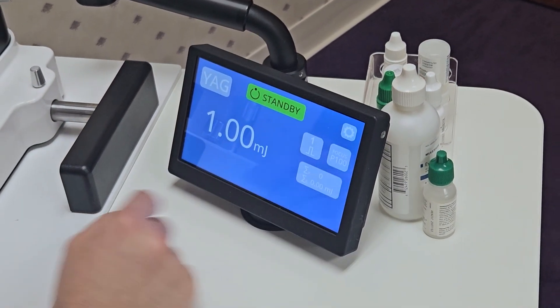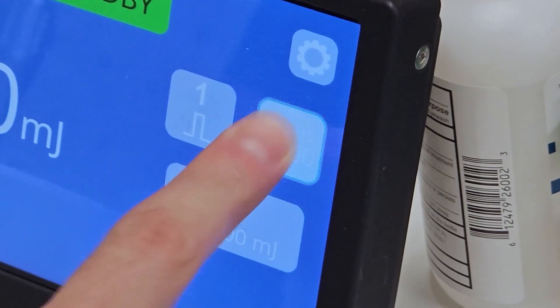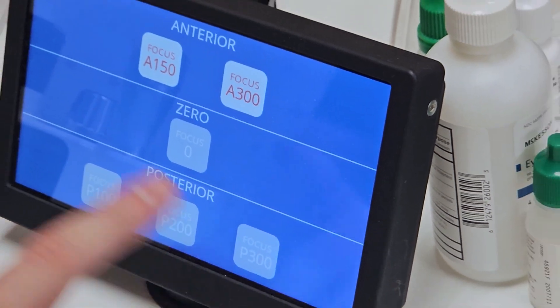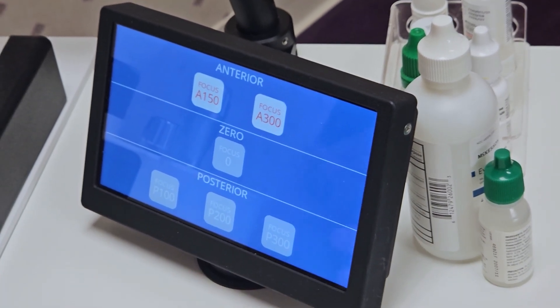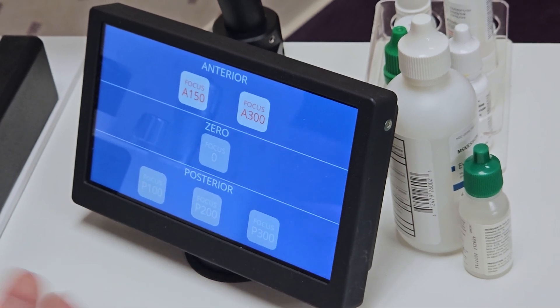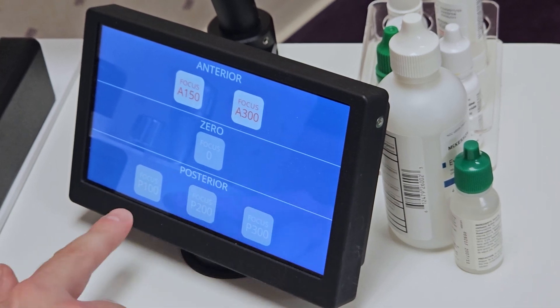That's the number of pulses. That's the focus, which defaults to 100 microns offset posterior, but you can change that. If you want to do directly on axis, you hold down for a few seconds. You've got basically your anterior focus if you want to move it in front, like if we're doing an anterior capsule treatment; zero focus if you're doing a PI or something; and then your posterior focus depending.